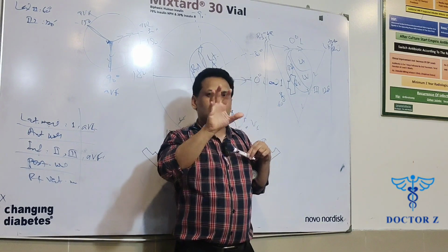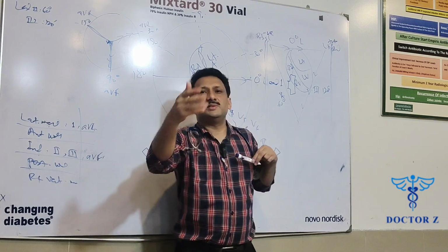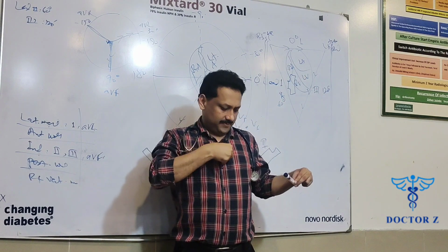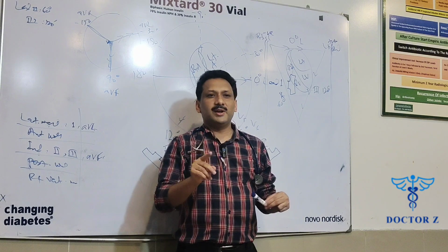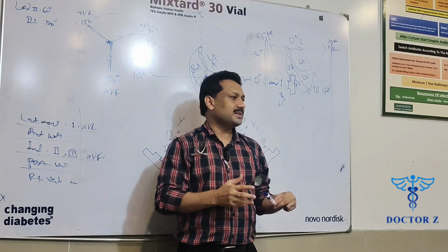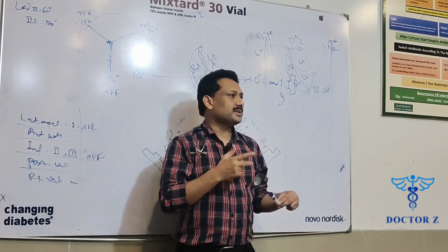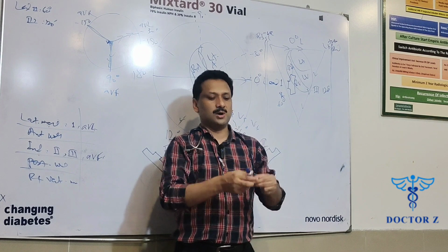As you place these leads, and as you might have seen somebody's ECG being done in casualty or in a ward setting, you must have seen different electrodes placed. When you see this, basically these are leads which are being placed, and these are cameras which are installed.